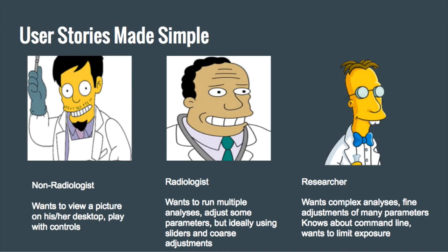Radiologists and other specialists who use MRIs on a more frequent basis may have slightly more complex needs, but fundamentally, CRIS helps them out by, again, allowing them to run analyses and share files without necessarily needing to have a powerful machine in their use. And much of the same goes for researchers.